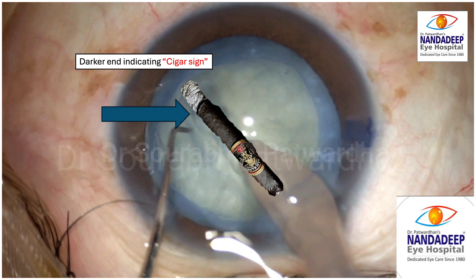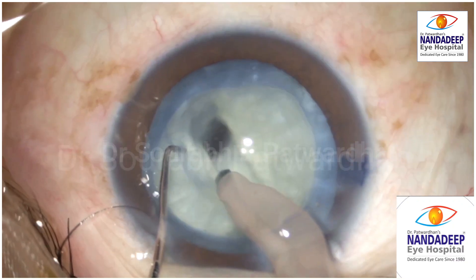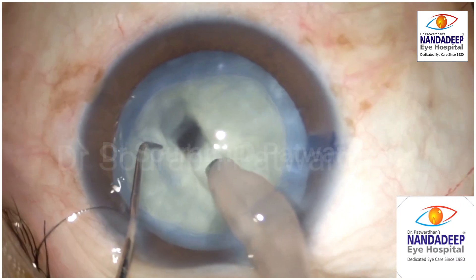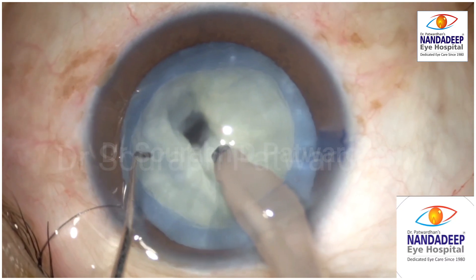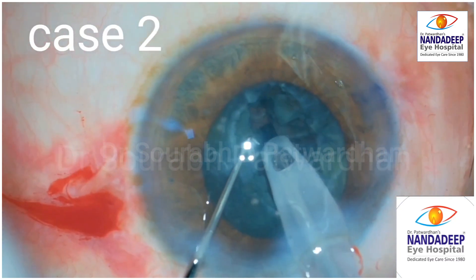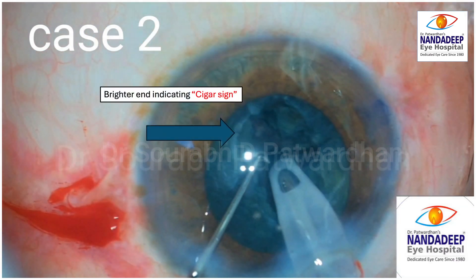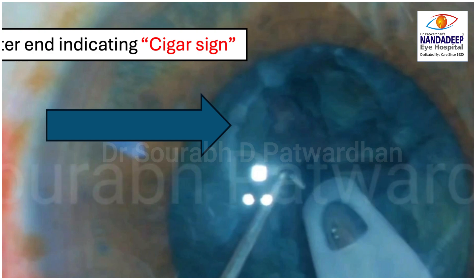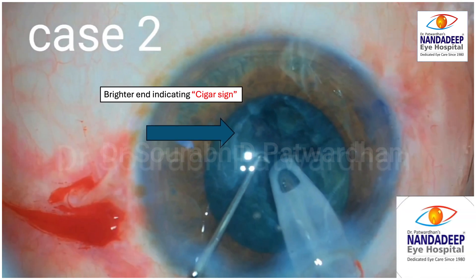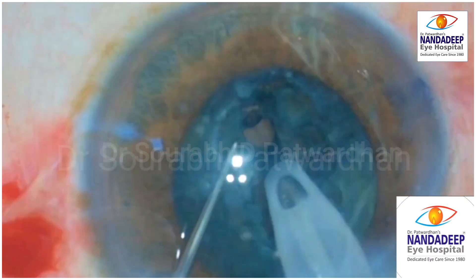When you see this sign, you have to avoid further trenching in that area. You can see that further trenching will lead to a punched hole and can cause posterior capsule rupture. Another case shows the lit cigar sign where the brighter end at the end of the trench indicates the trench is deeper in that area, and further trenching in that area caused a punched hole.